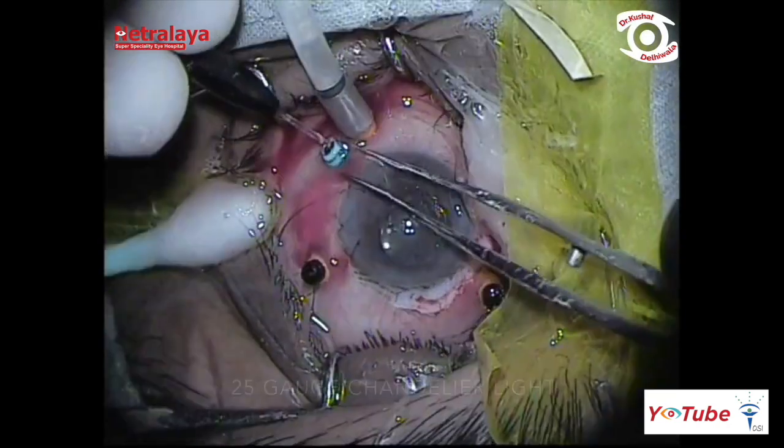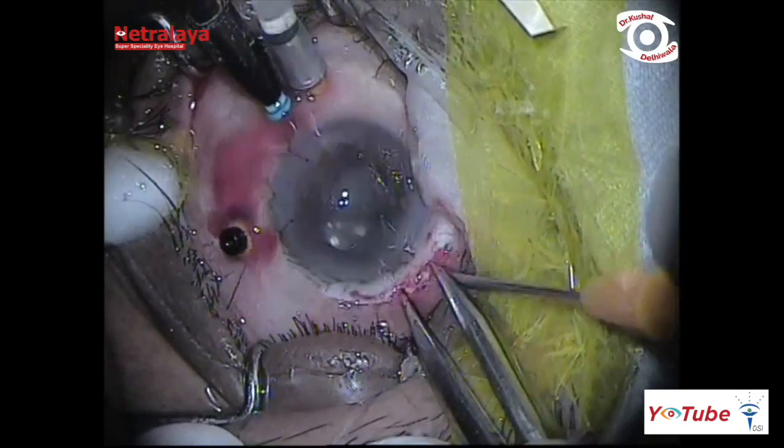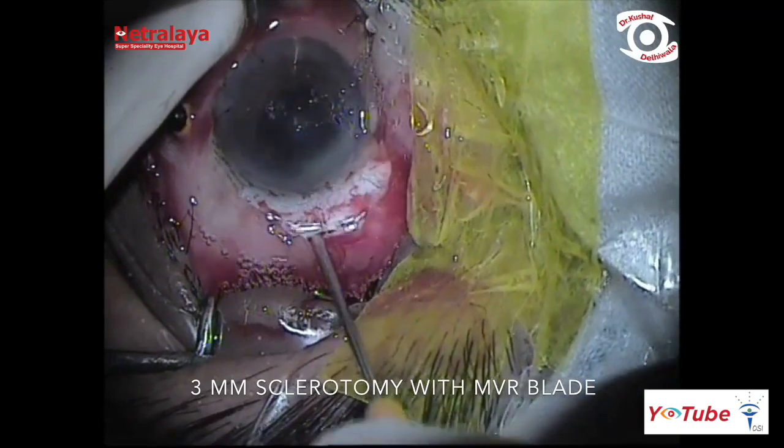A 25-gauge chandelier light was fixed infratemporally for bimanual surgery, and the supranasal port was enlarged to 3 mm using an MVR blade.